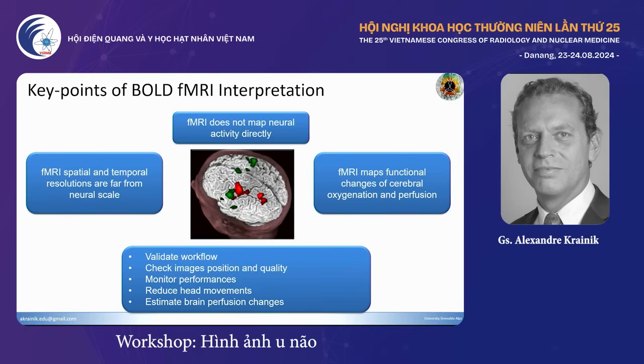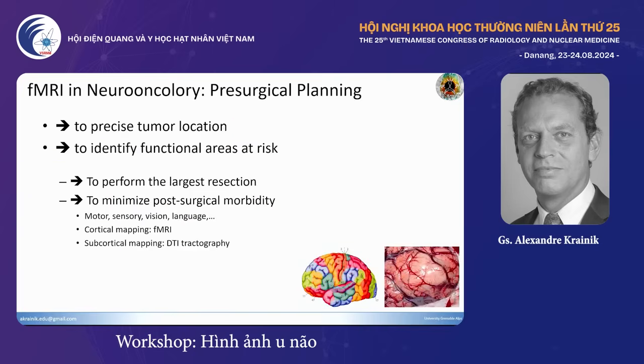Then anyway, it requires a certain habit. The workflow must be mastered by the whole team. Usually you have to be really nicely helped by your technician, and you have to check for the image quality as well, to monitor the performance, and to avoid that the patient moves the head a long time.